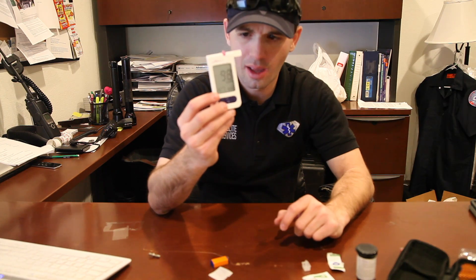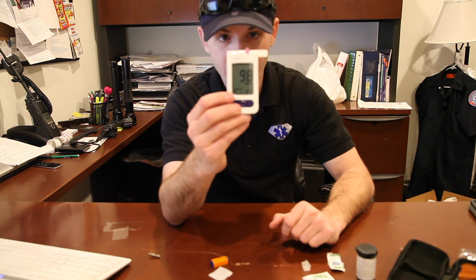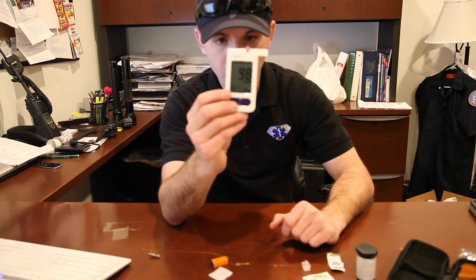It's going to count down and analyze the blood, and then you get a reading of 98 milligrams per deciliter. That would be our blood glucose reading.